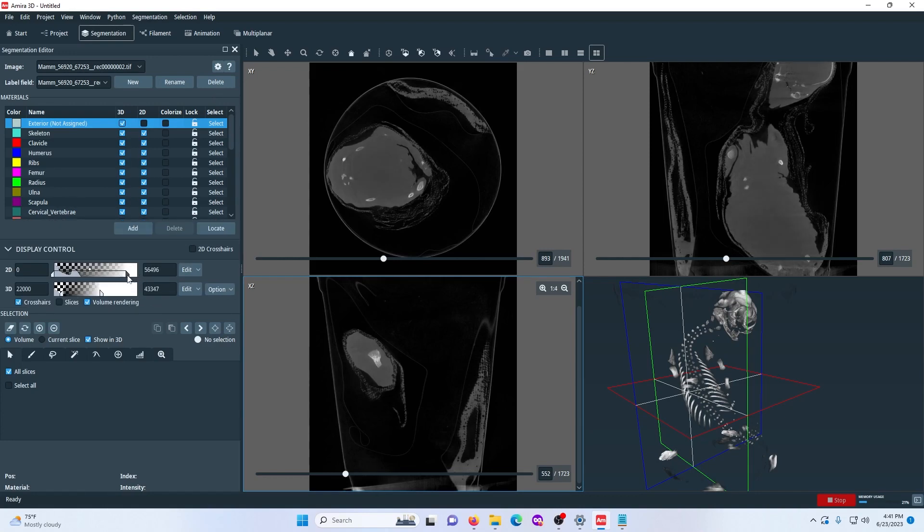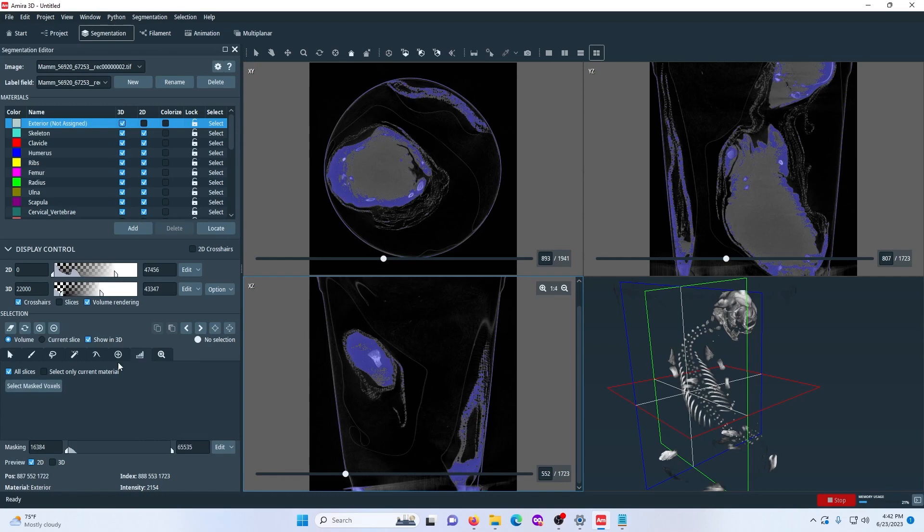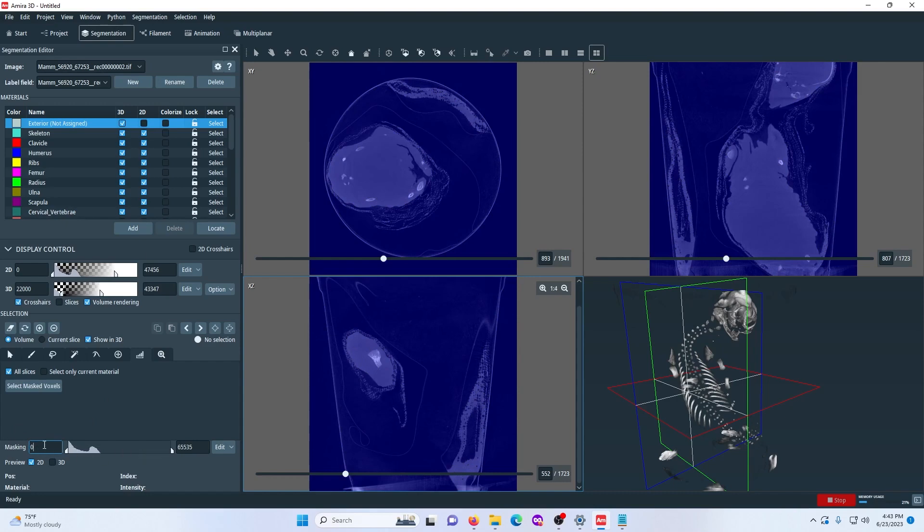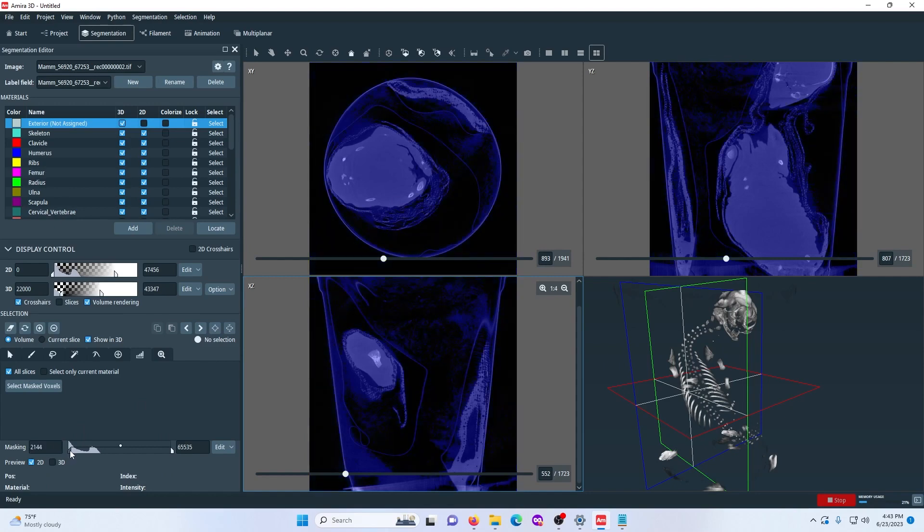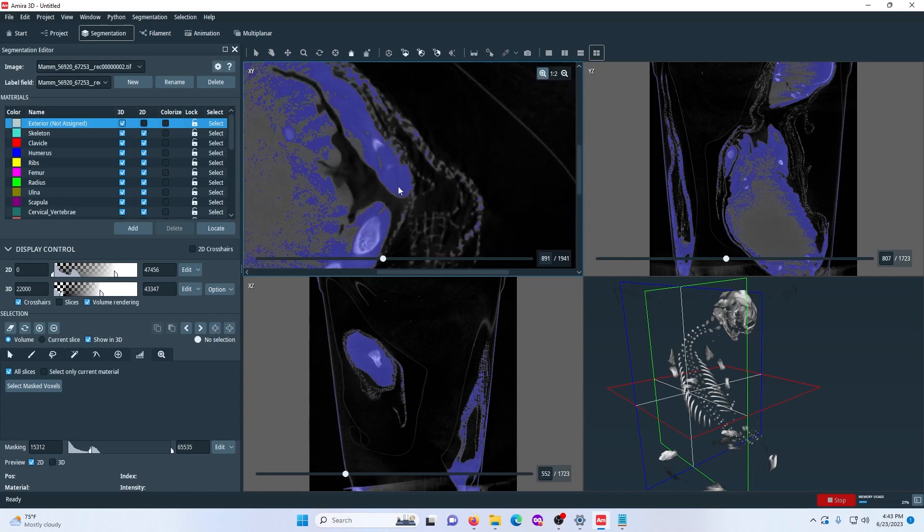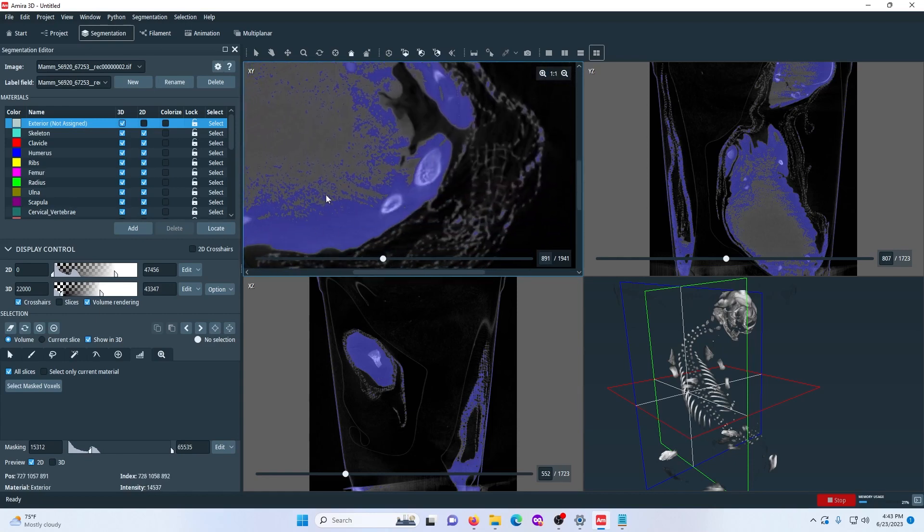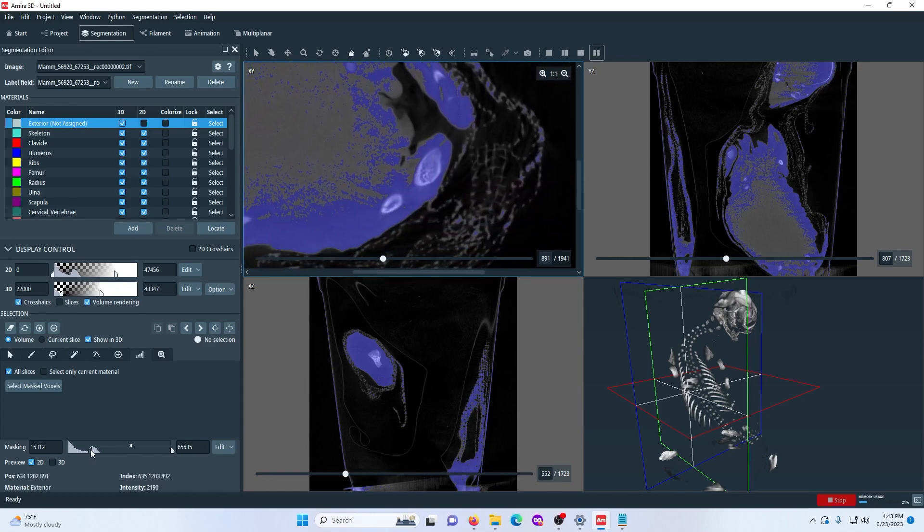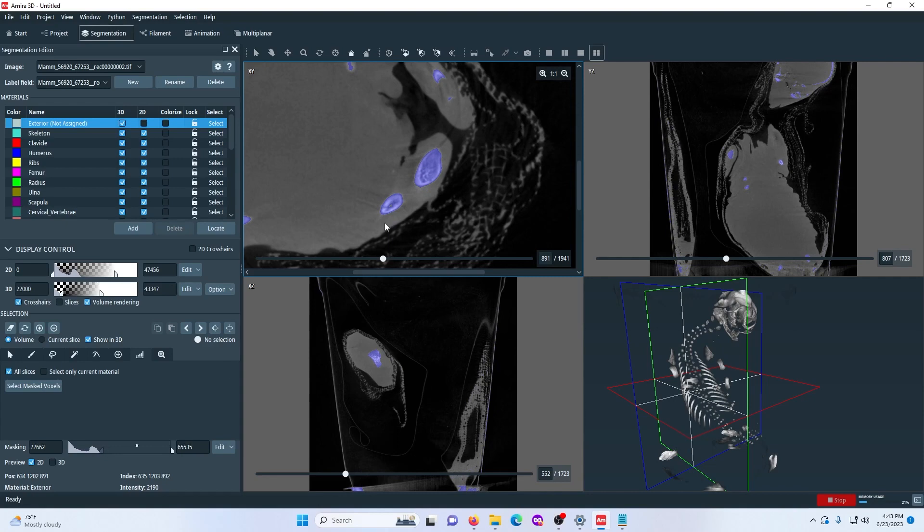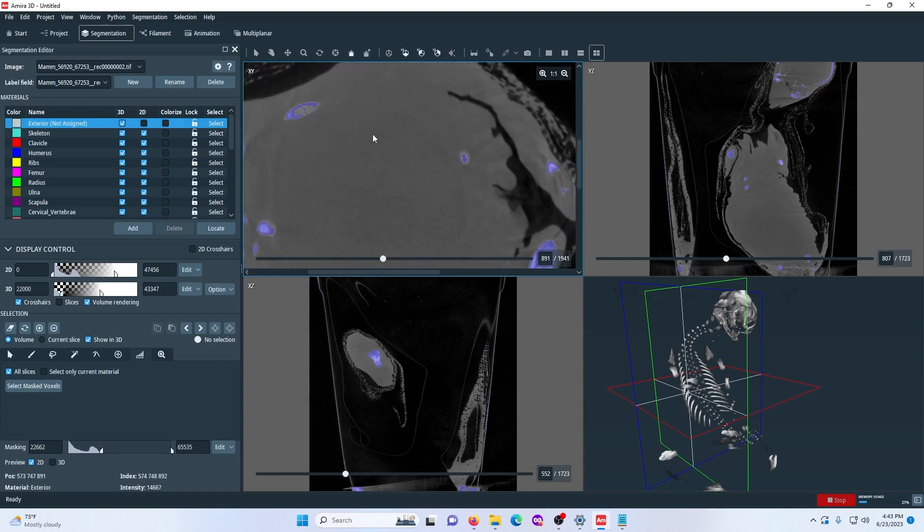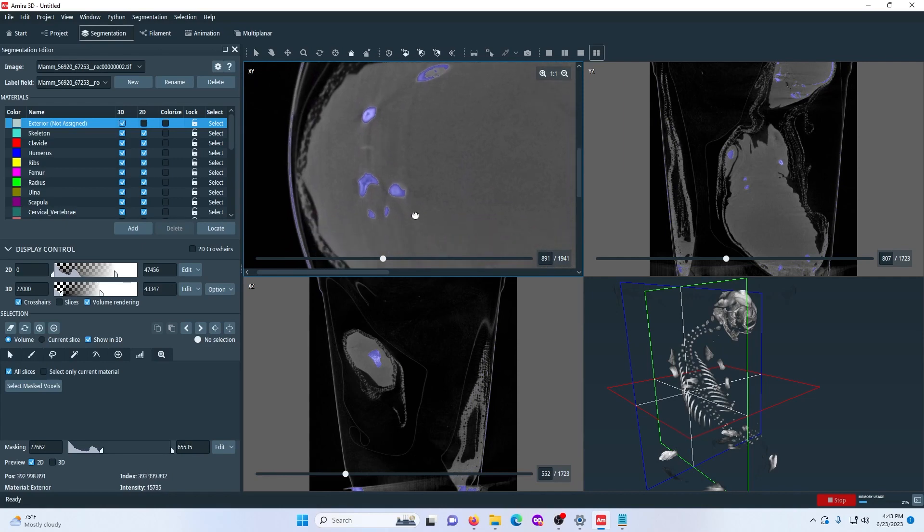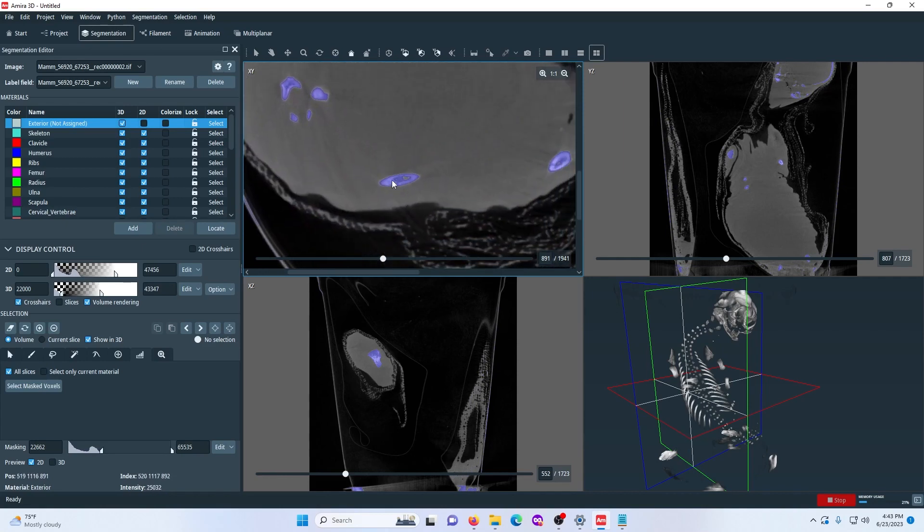That way you can either show less stuff or boost the contrast. So the first thing I like to use is threshold and this enables you to select material or select anything that's at like a certain density. So right now I'm selecting material between 0 and 65,535. So that'll select everything. But let's say I only want to select material that's a certain density or hardness, I guess. So you can see that as I up the lower bound, less and less stuff will be detected, will be selected. So I want to do this so it only selects the bone. I don't want any of this noise. So I'm going to bring this up to around, that looks good, maybe a little bit more. This looks like a good threshold.